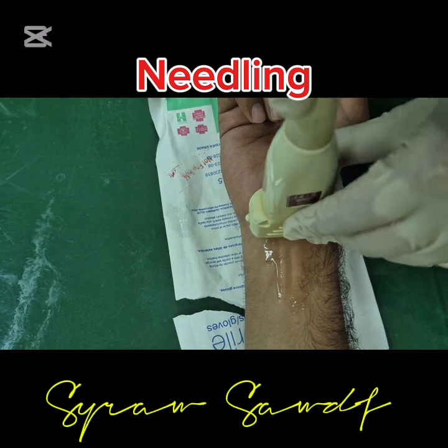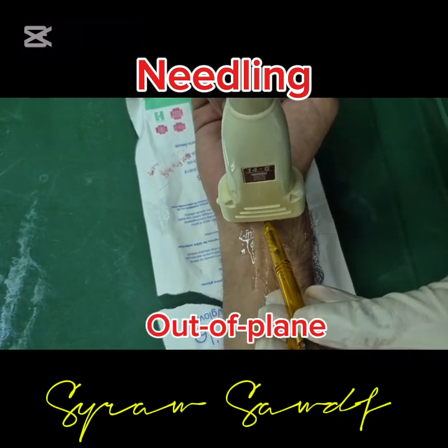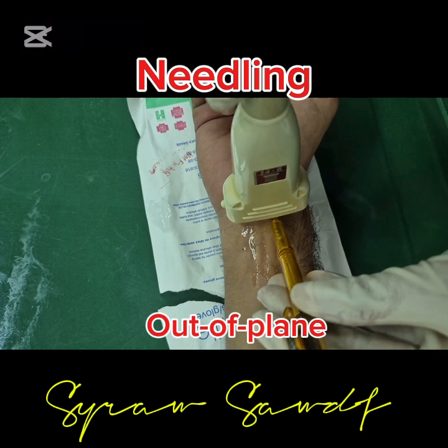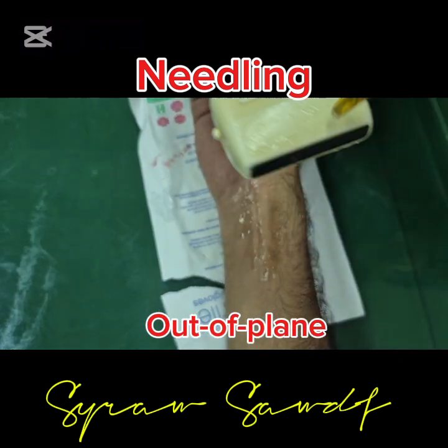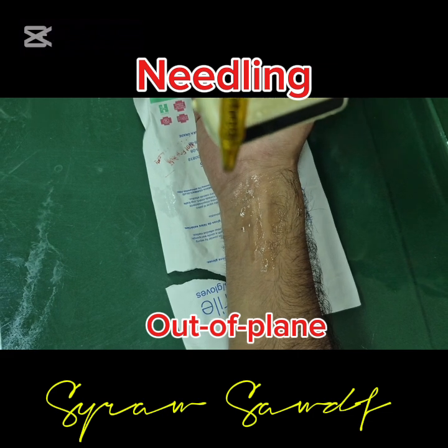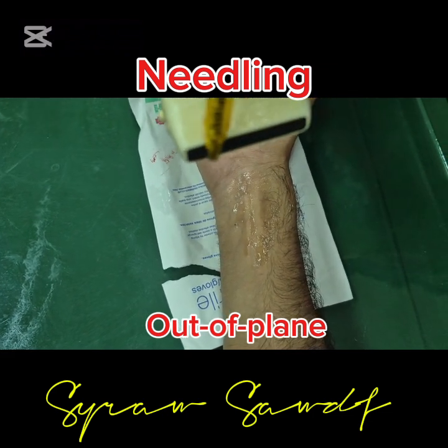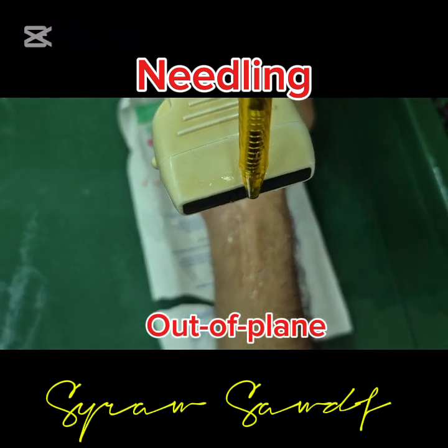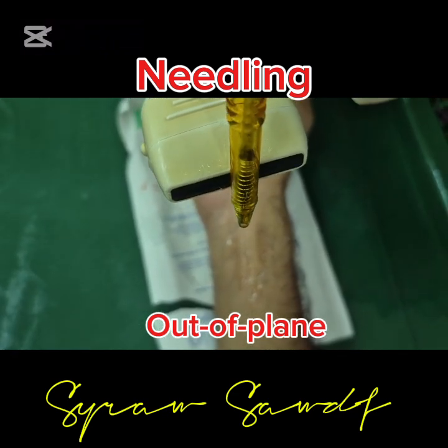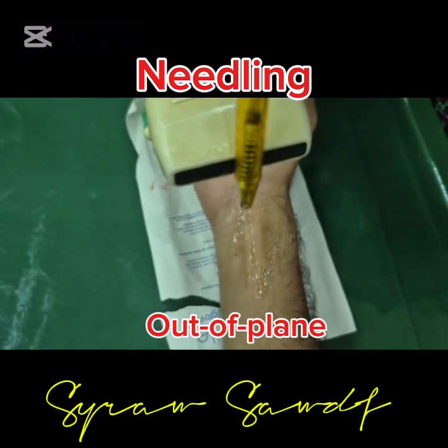Now what is out of plane? Out of plane means you are going like this. Now let me show you. Out of plane means, this is the plane of the beam of your probe. Now just the tip or part of the needle will be under the beam, not the whole length of your needle.